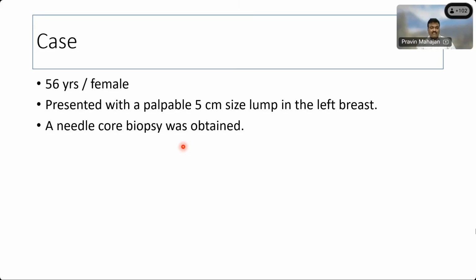One is that with biopsies we are very confident making the diagnosis. The other thing is you can do the breast biomarkers, which, like I just told you, are predictive markers to decide the treatment. Sometimes the treatment can be upfront surgery, sometimes upfront chemotherapy followed by surgery. So it's very important that we get a biopsy and then do the markers on it to help them make the clinical decision. So this is a true cut biopsy.